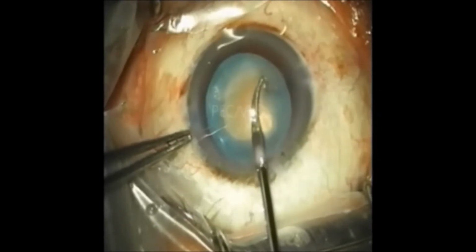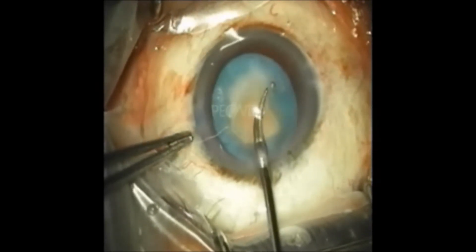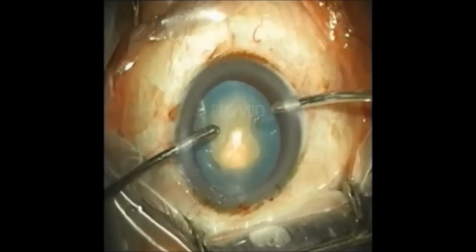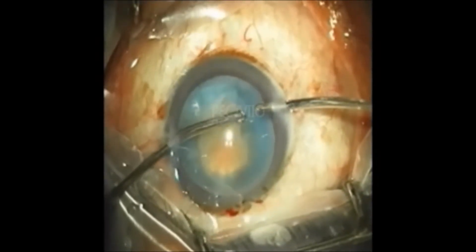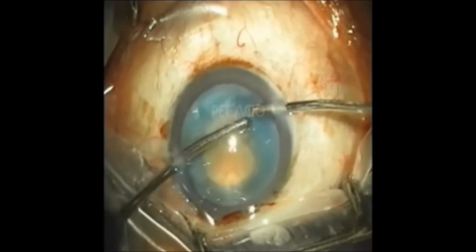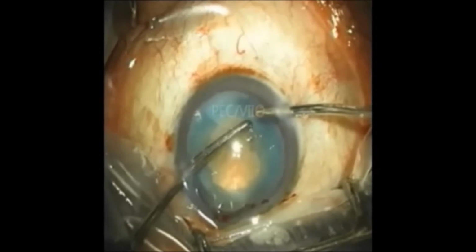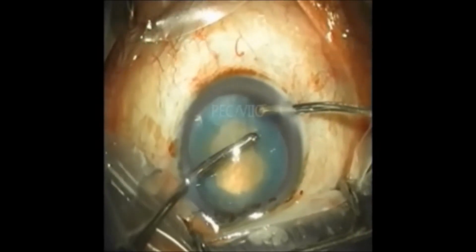Now the second stage of the rexis is started with a nick on the rexis margin. The surgeon again goes in with bimanual irrigation and aspiration, holds the torn edge of the rexis margin and enlarges the rexis.